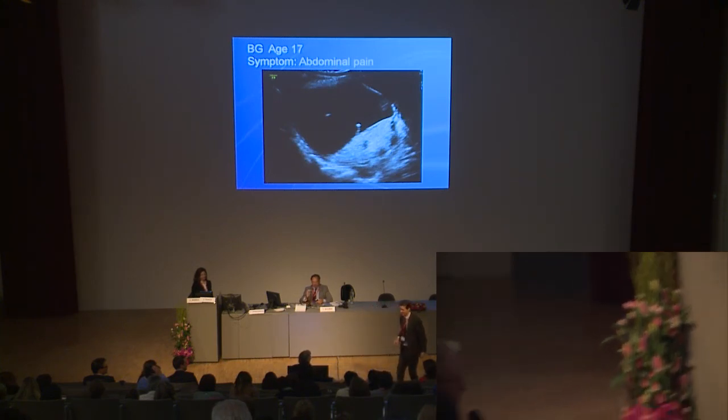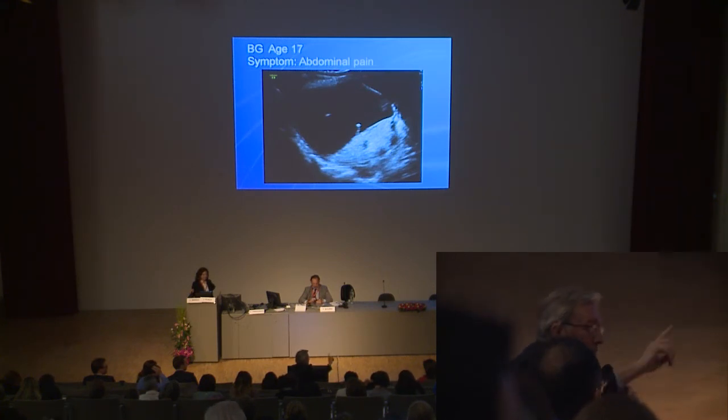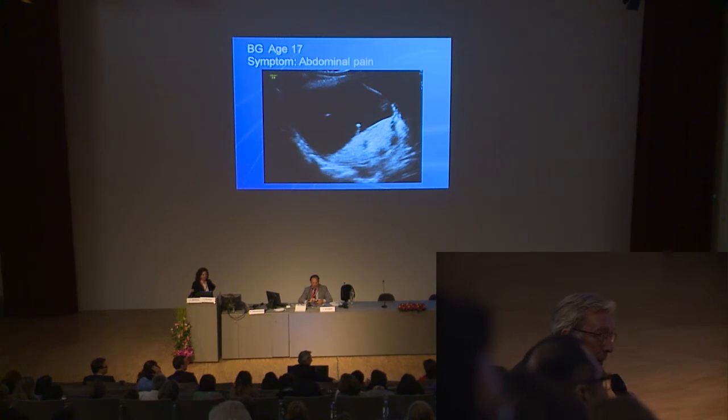Yes, but the problem is that those who have less experience, who do not recognize this as an ovarian fibroma, will have many more patients directed in the wrong way.